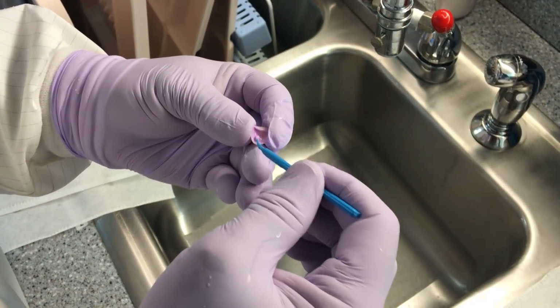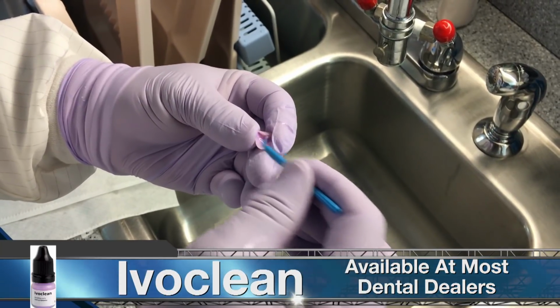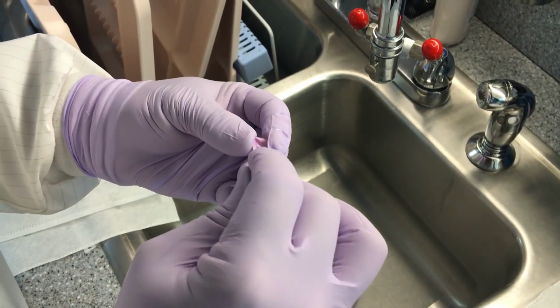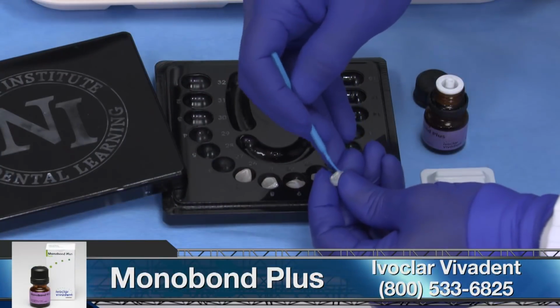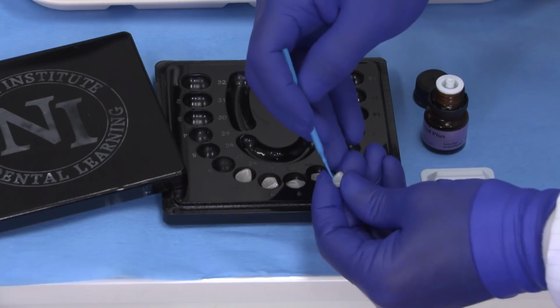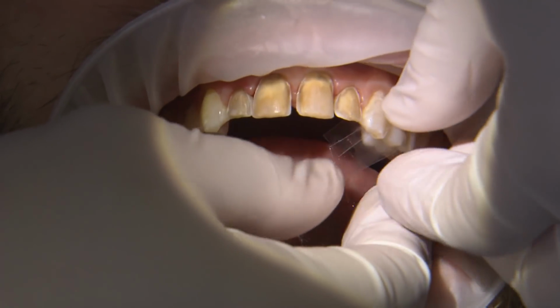To prepare the veneers for cementation, we apply Ivoclean to the internal surfaces for 20 seconds and rinse and dry them out. Afterwards, we apply a coat of Monobond Plus, which contains the required silane coupling agent to allow the resin cement to adhere to the ceramic surface.